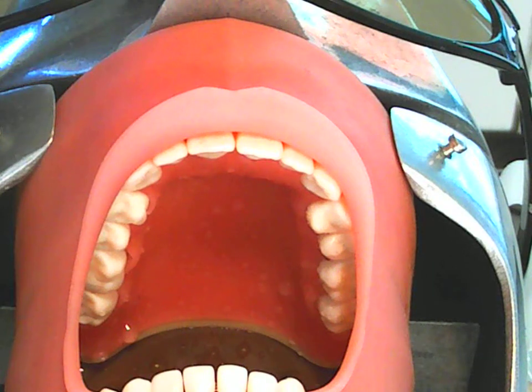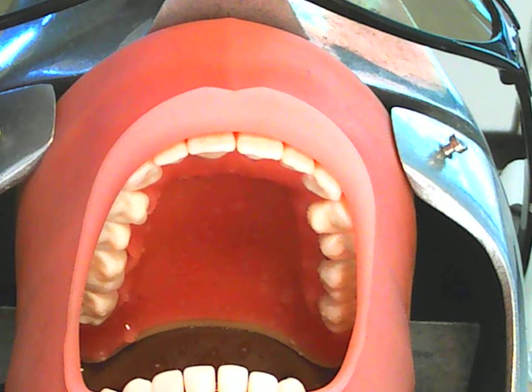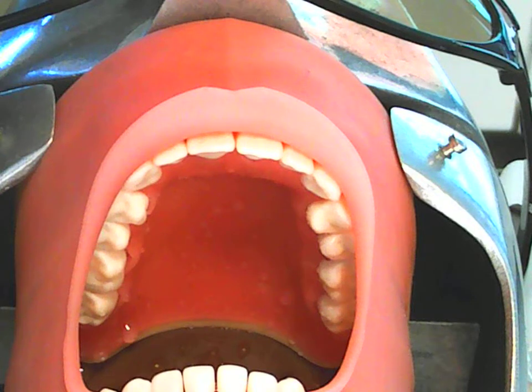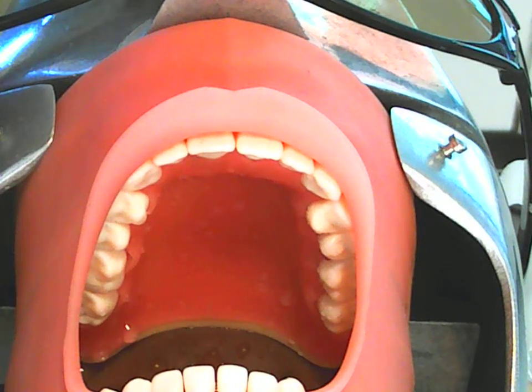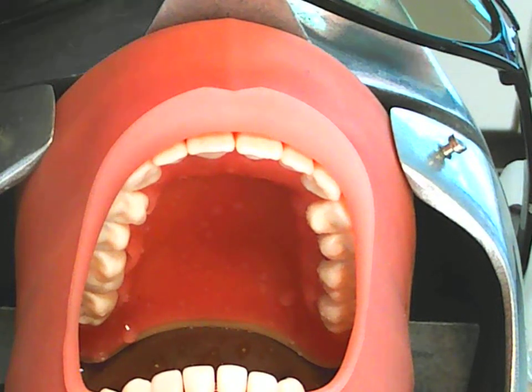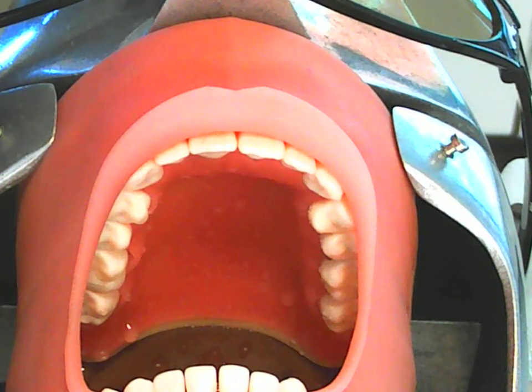Once you receive client consent, please ensure that you are maintaining your principles of ergonomics, have yourself, your client and equipment in the proper positions. Also, practice your instrumentation techniques, ensuring that you're using a fulcrum when applicable at all times, and that your mirror skills with using indirect vision and retraction are also being used.